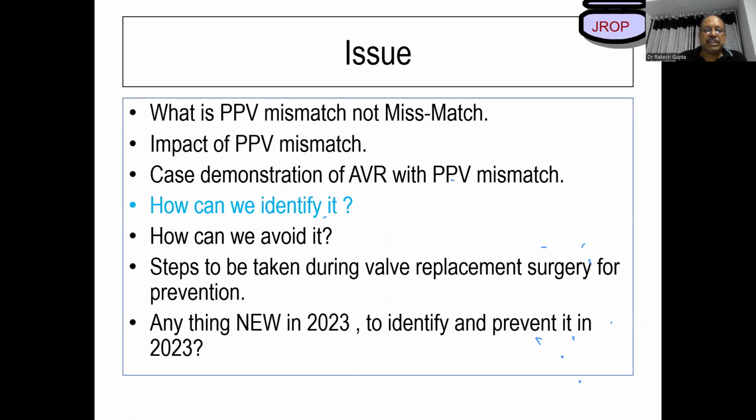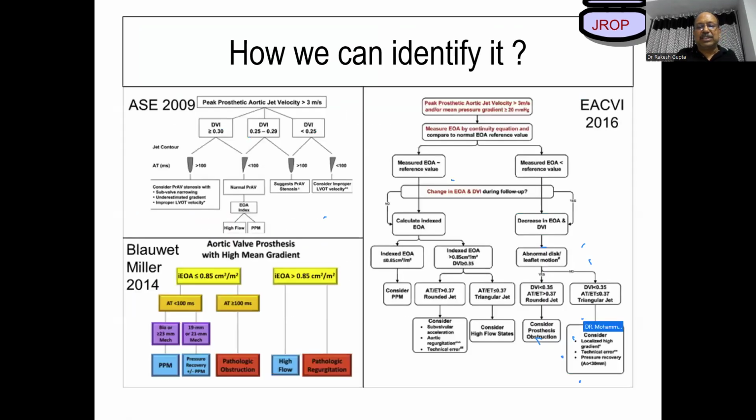So this is one patient where we really had PPM in our subject, and we tried to look at this patient in this particular phenomenon. Because of persistent LVH, persistent high blood pressure, persistent gradients, and when we looked at his body surface area versus the valve number, it was only 21.